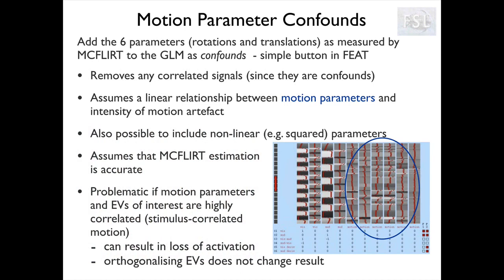The first option is to add motion parameter confounds in our single subject GLM. If you remember the FEAT report, we had three plots with the three rotations and three translations over time that were measured during the realignment step with McFlirt. With a simple button in FEAT, we can add them as confound regressors in our GLM. And if the data can be explained by a linear combination of the motion parameters, then the effect is going to be explained by those regressors and it's not going to end up in our contrast of interest.